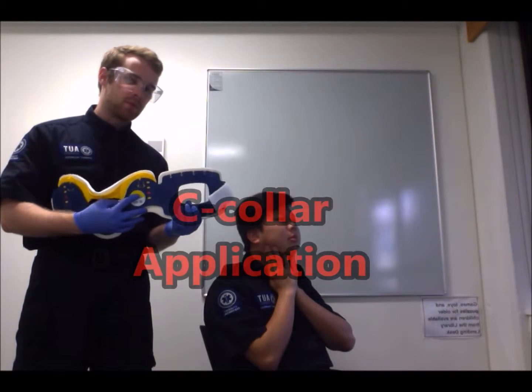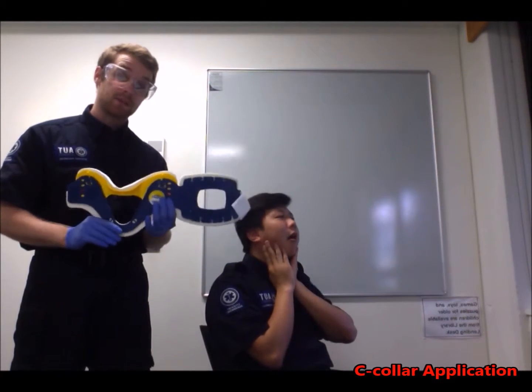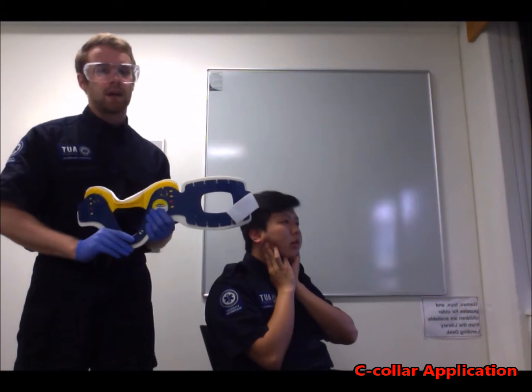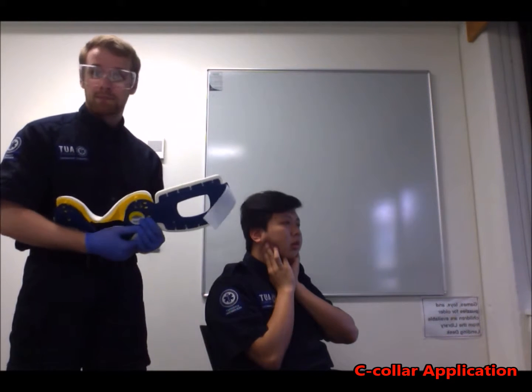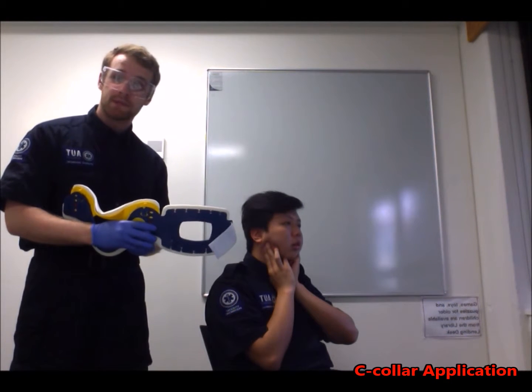I'm going to demonstrate proper use of a C-collar. So when attending a patient that has a suspected C-spine injury, you would perform a NEXUS assessment. This would be to determine if there's any tenderness at the posterior midline of the C-spine, or there's evidence of intoxication. This will be done through a PEARL assessment.